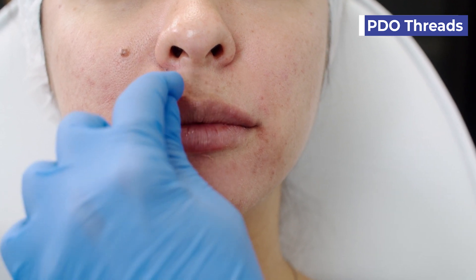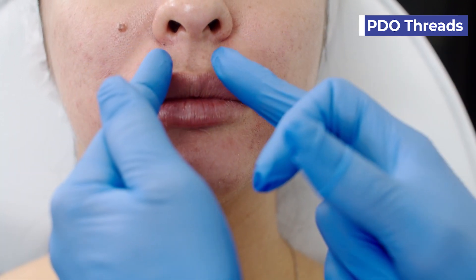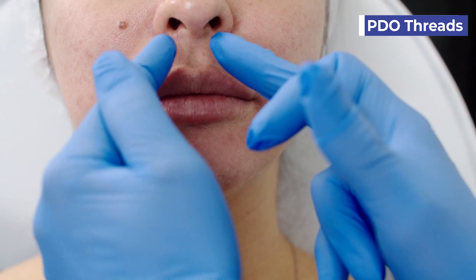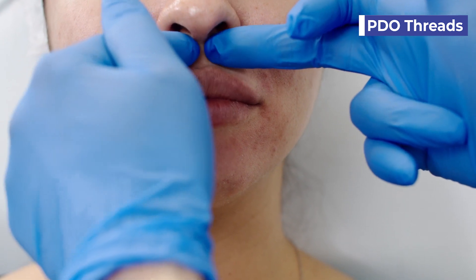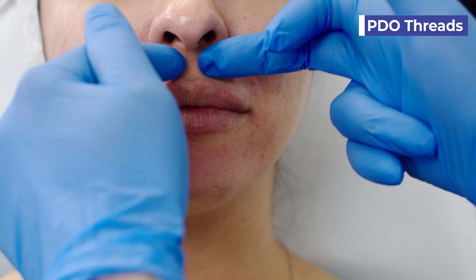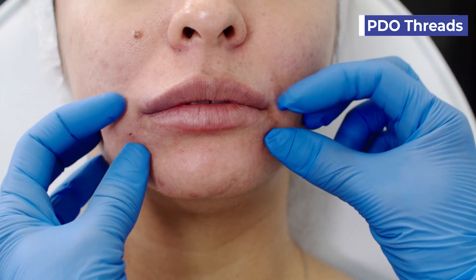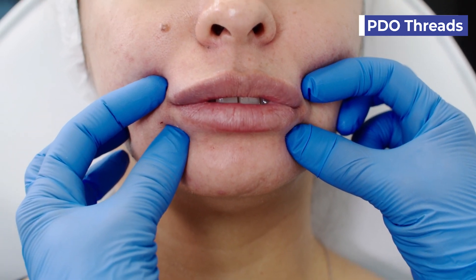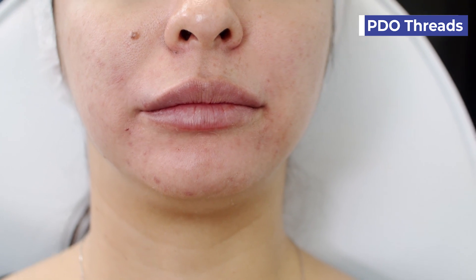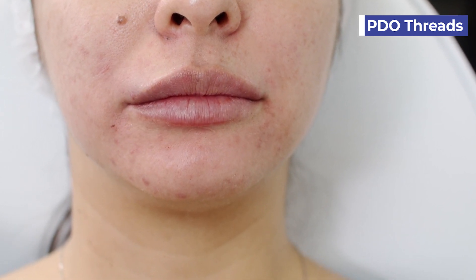Looking at the patient's lips, I would give her a little more enhancement of the philtrum with the philtrum columns. I would be able to put PDO threads all the way from the tip of Cupid's bow to help peek it up and lift up her lip. You never want to over-enhance it because you don't want the patient to have a duck lip. You can also add PDO threads in the oral commissures for structural support, as well as in the mental crease, where I already did a little bit of filler to smooth out the skin.